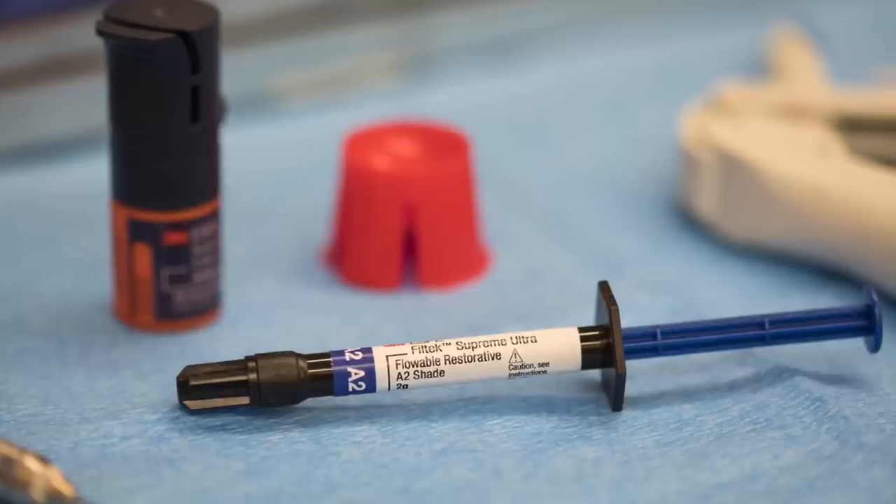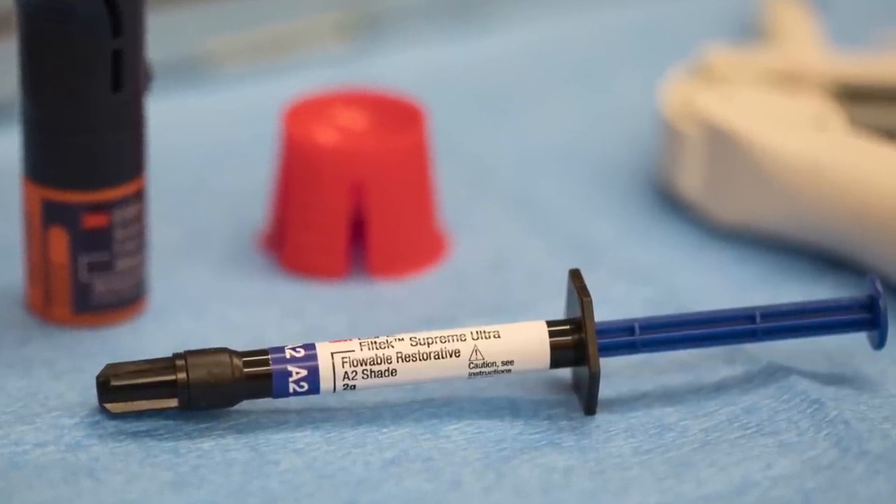After you cure your bonding agent, some providers recommend placing a little flowable composite onto the preparation over that bonding agent on the dentin. Only do this step if you have the space available, as it will thicken the layer and take away some restoration space. Whenever you cure a bonding agent or composite, the top layer is unpolymerized — we call this the oxygen inhibition layer. It's recommended that you remove this layer regardless of whether you placed just bonding agent or also flowable.